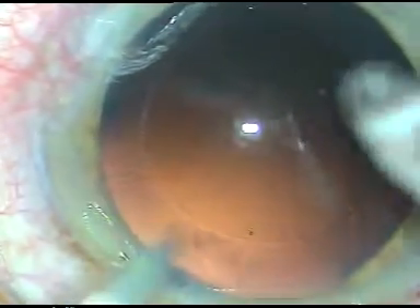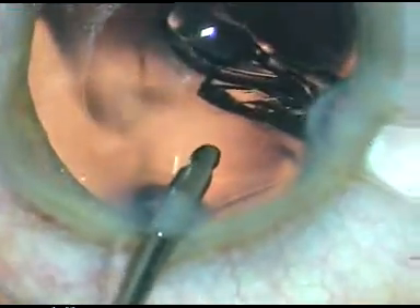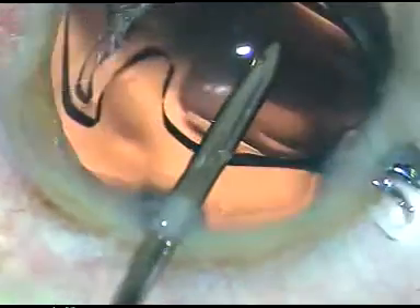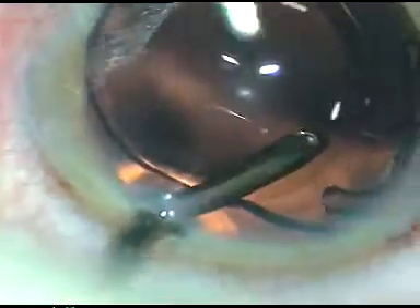Now it is time to implant the IOL. I am going to implant it under irrigation. Irrigation forms the anterior chamber. The lens is injected into the capsular bag — the leading haptic goes into the capsular bag and the trailing haptic is guided in with just a nudge. The trailing haptic also goes into the capsular bag. Whatever little viscoelastic substance was there in the lumen of the cartridge is irrigated out.